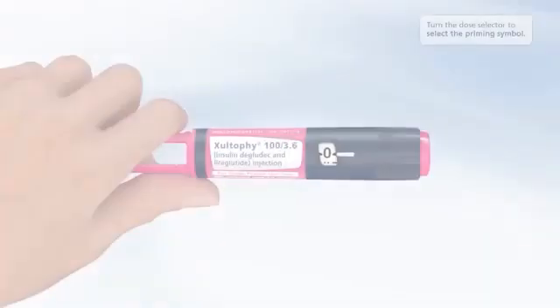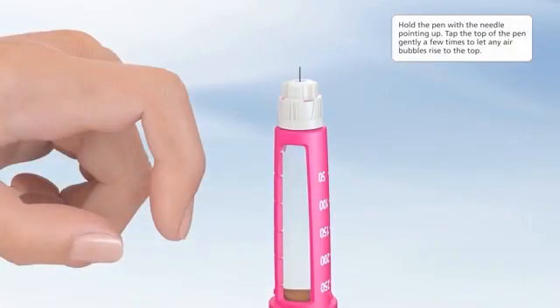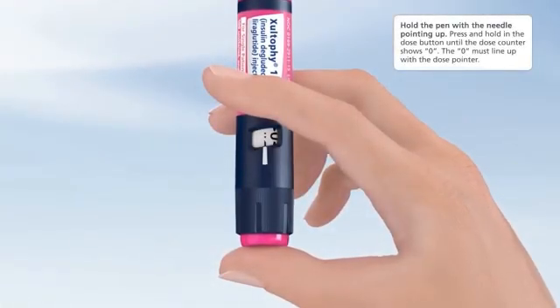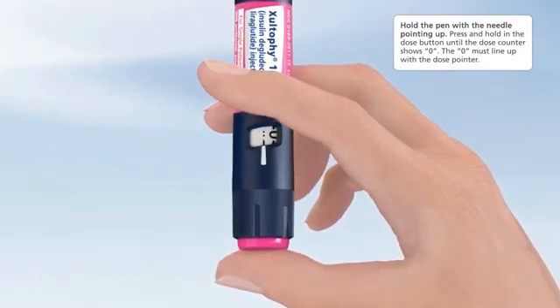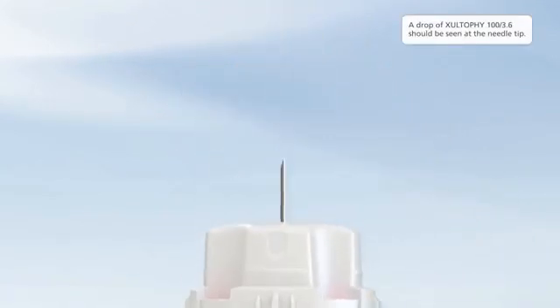Priming your Zultify 100 3.6 pen. Turn the dose selector to select the priming symbol. Hold the pen with the needle pointing up and tap the top of the pen gently a few times to let any air bubbles rise to the top. Press and hold in the dose button until the dose counter shows zero — the zero must line up with the dose pointer. A drop of Zultify 100 3.6 should be seen at the needle tip.